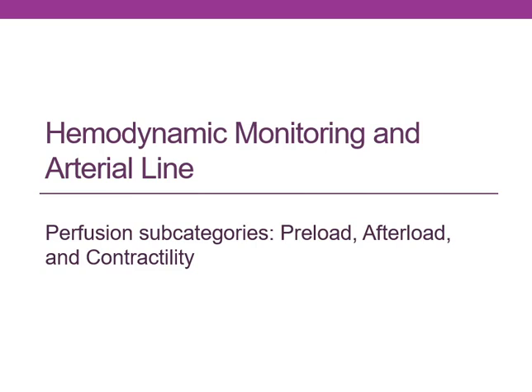This is all about the heart beating and really specific parameters we can monitor. This is done in the ICUs. That's really the only time that you will see this. It can be done in surgery. Possibly a step-down unit might have an arterial line, but very specific.